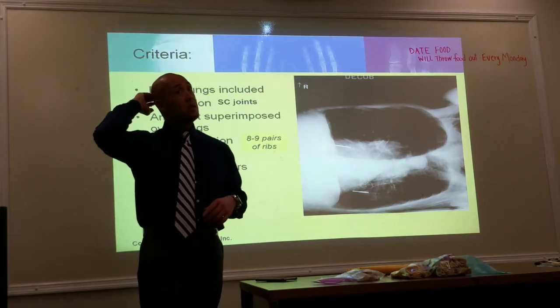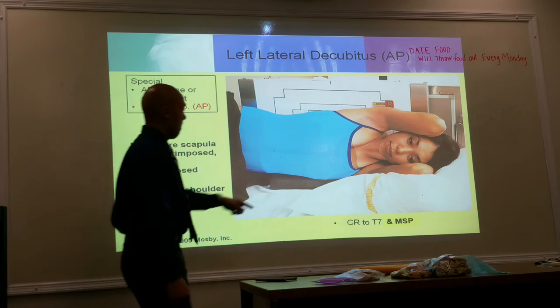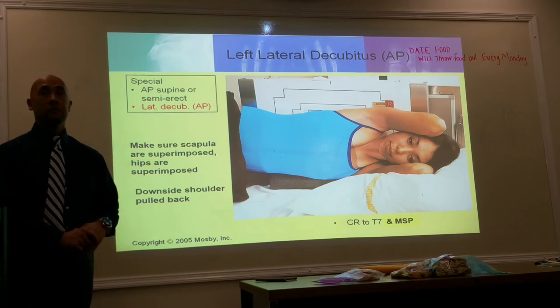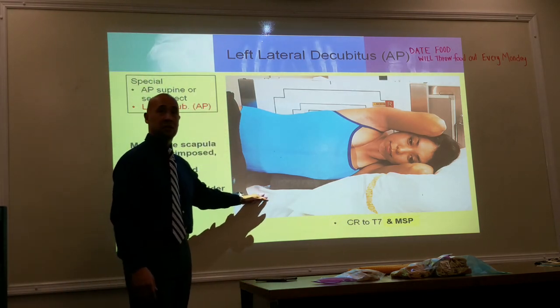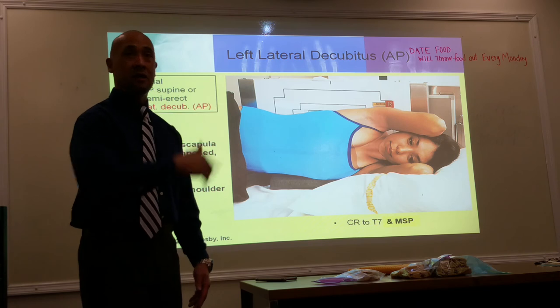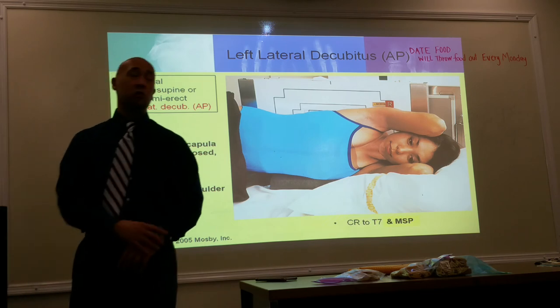You were talking about propping it up for divergent beam, right? Is there any way, if you're doing a portable, not when there's a bucky tray right there, that you just put the IR that's portable on the edge of the table lower, below the level of the cushion? Yeah, you can do that too. But you can't do it on an x-ray table, because the x-ray table has solid material. You can do it on a bed where you place the image receptor below the level of the mattress or the cushion, because you're just trying to get it in the middle of the IR. Doesn't matter where it is. Exactly.